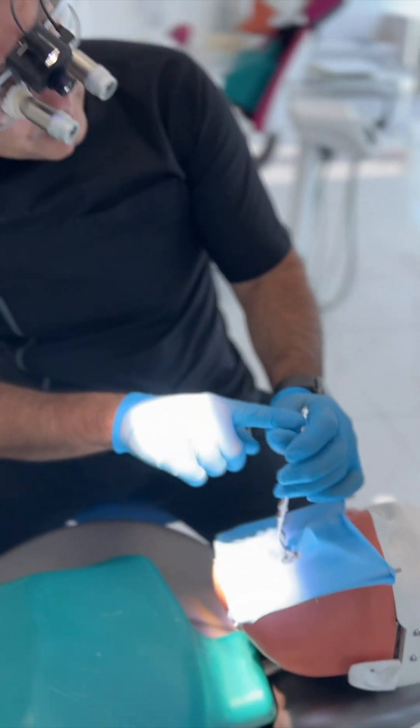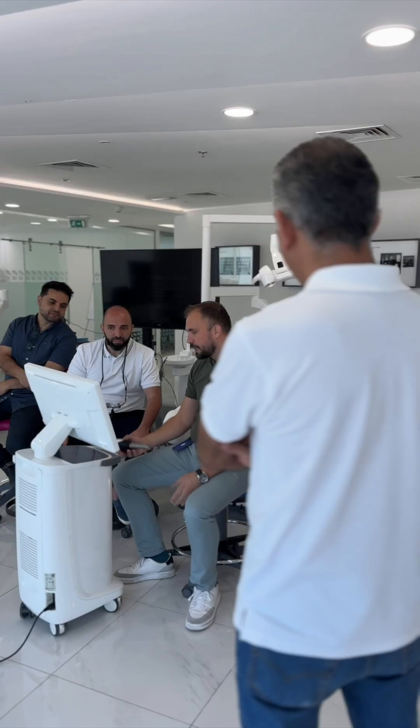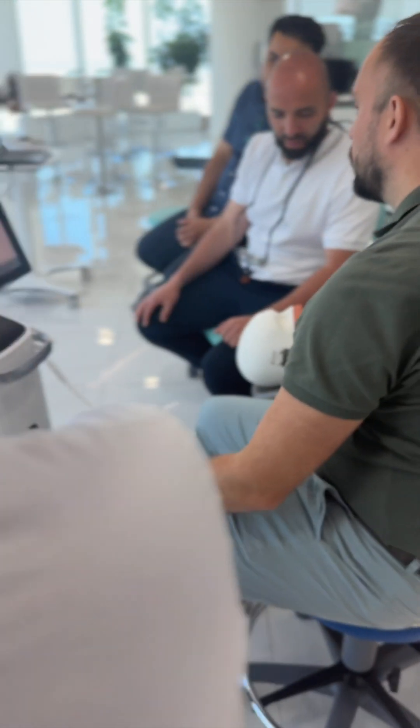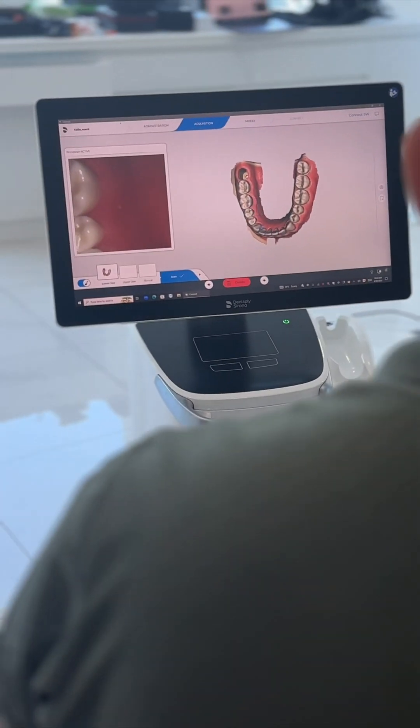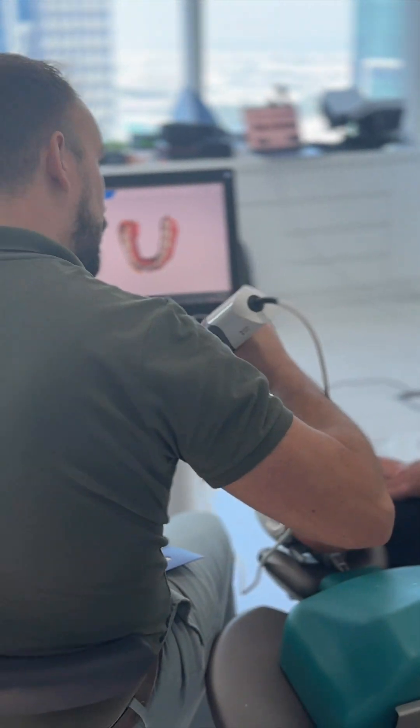It's all in the forceps — my right hand is free to control the clamp. I go and observe where the tooth is. Consider the most accurate light in the scanner because this is the focal point of the scanner, and the motion sensor helps me to virtually rotate this. This is how I scan.